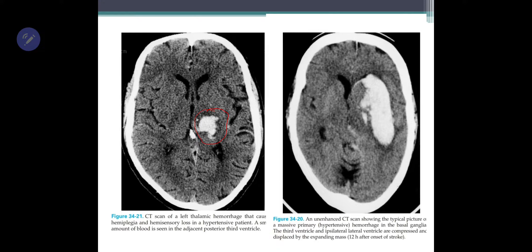The next bleed is a massive hypertensive hemorrhage in the basal ganglia. It is extending into the ventricle as well on this side, and it is causing a midline shift — the midline is supposed to be straight but it is deviated, indicating significant mass effect from this particular bleed.